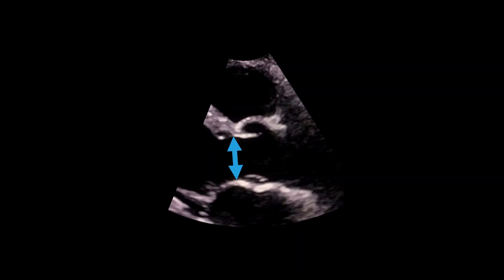The third piece of information needed is a measure of the diameter of the LVOT. This measurement is probably best made at the annulus level where there are clear landmarks, though some prefer to aim for a similar position to where the pulsed wave Doppler recording has been made. In order to improve measurement accuracy, a zoomed parasternal long axis view should be used.